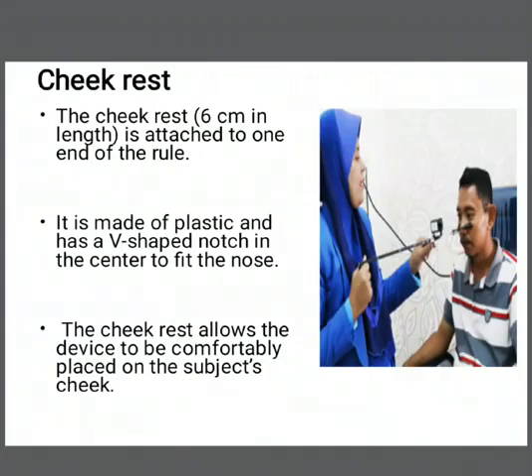The cheek rest is six centimeters long and is attached to one end of the square rule. It is made of plastic and has a V-shaped notch in the center to fit the nose of the patient. The cheek rest also allows the device to be comfortably placed on the patient's cheek.